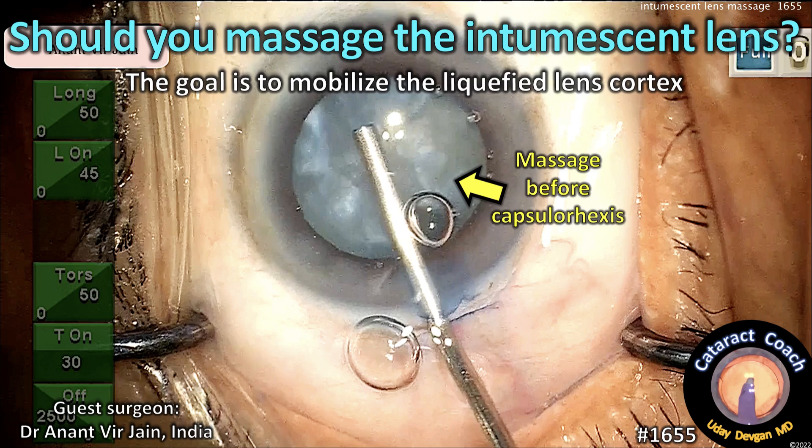CataractCoach.com. Should you massage the intumescent lens? The goal is to mobilize the liquefied lens cortex.